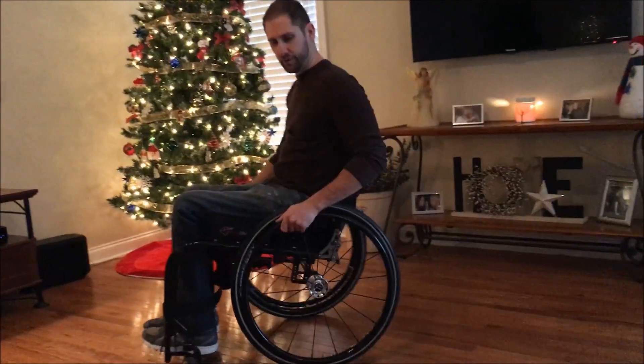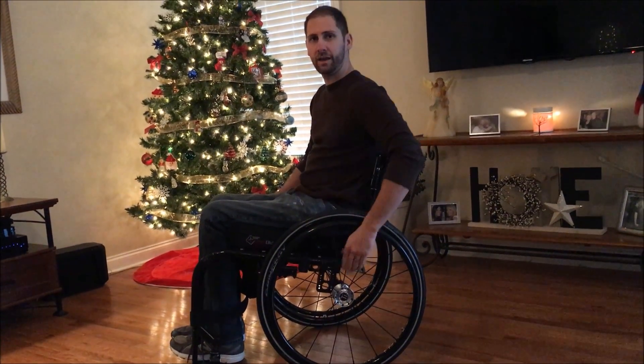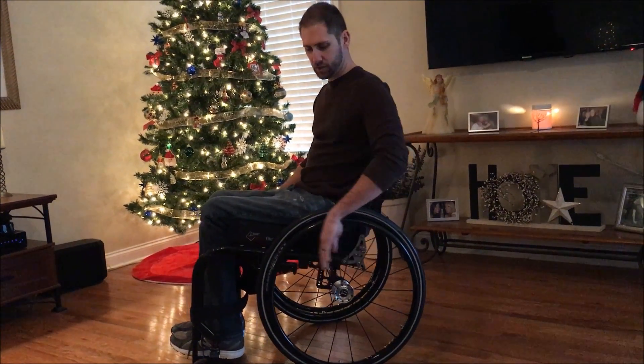Hey guys, it's Brian. Today I wanted to talk about wheelchair center of gravity and how you can adjust it. Just real quick I want to kind of talk about what it is. The center of gravity of your chair is how far forward or how far back the axle is in relation to the chair.